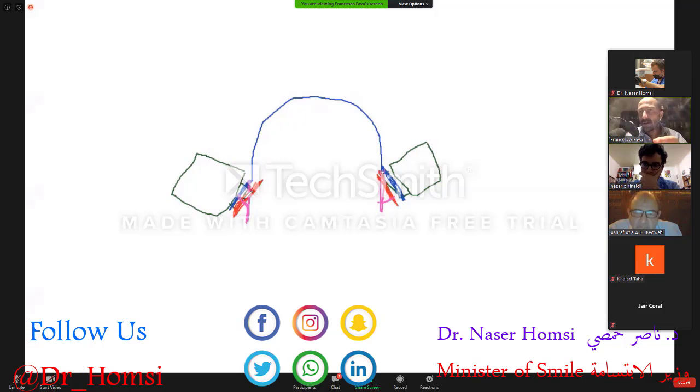This is quite an easy way to check the transpalatal bar activation. This is a first idea. And then, as the colleague said, it is indicated to insert some expansion force, but it's quite easy to do. So the molar will tend to derotate and to go in a backward direction.